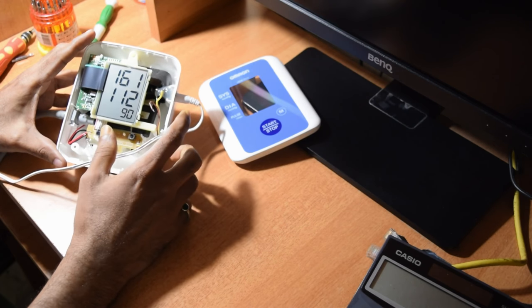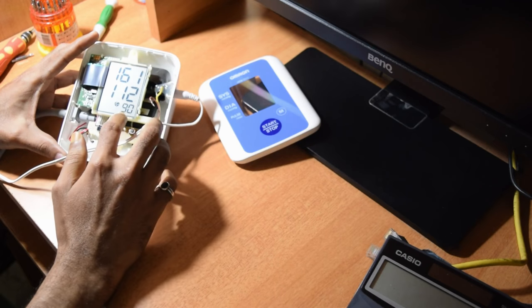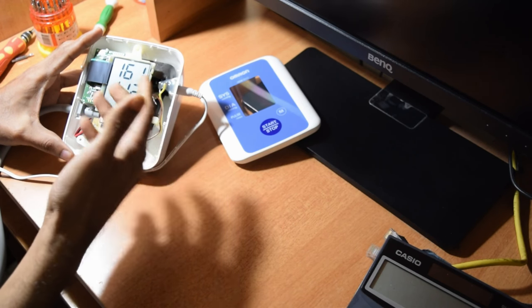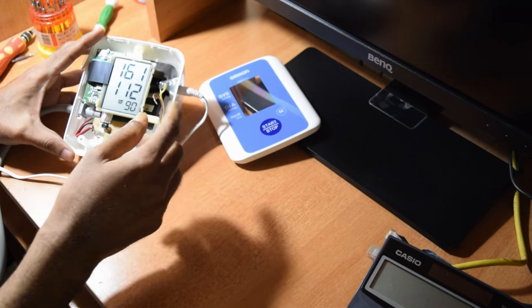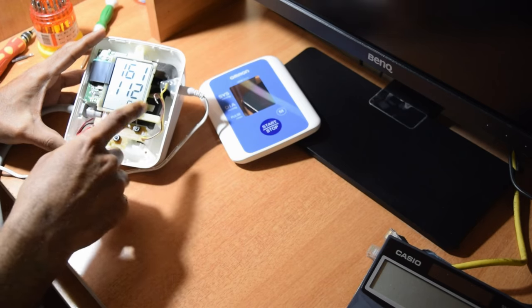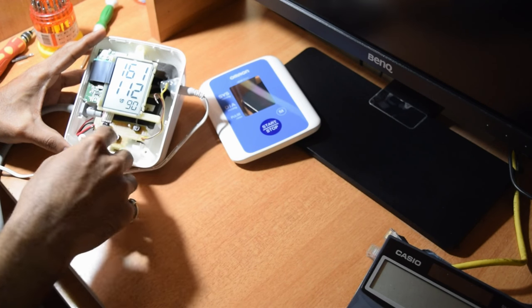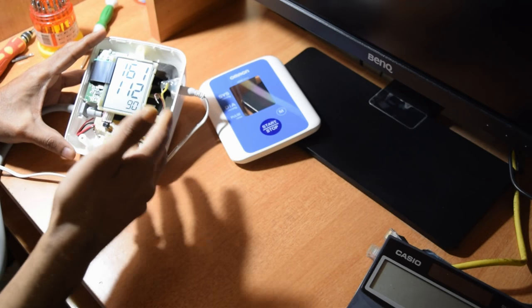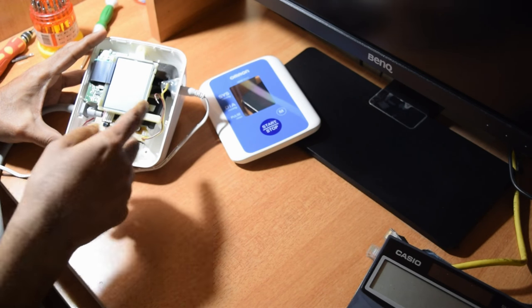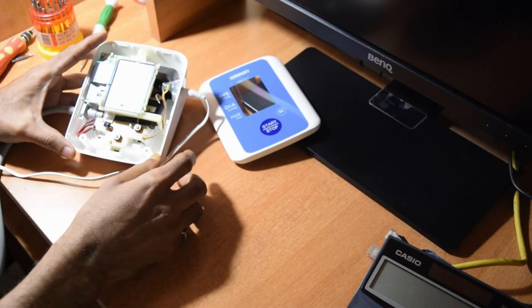Yeah, as you can see, it measures the systolic, diastolic and the pulse rate. Since I'm shooting this video, I believe I got a bit more blood pressure. So that's what it is. Once in a while, you can do a couple of trials in case you find anything crazy. I would highly recommend, even for normal operation, that you take a couple of samples so that you get more accurate readings. So you can just stop and then restart, and then you can take one more sample.